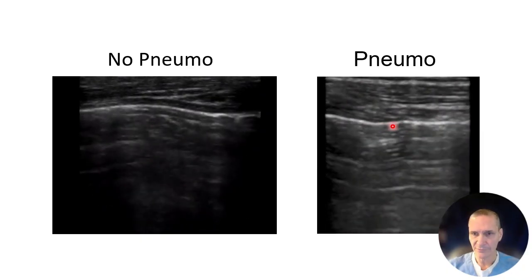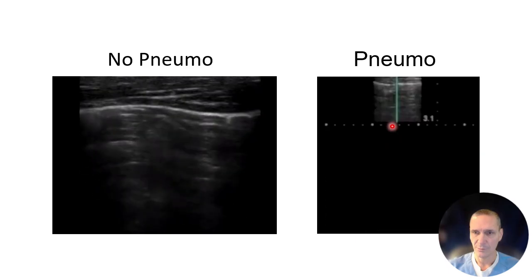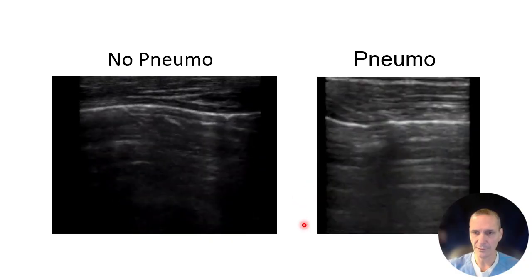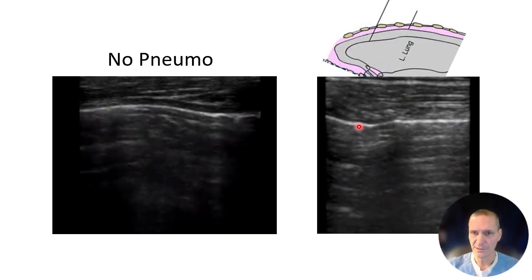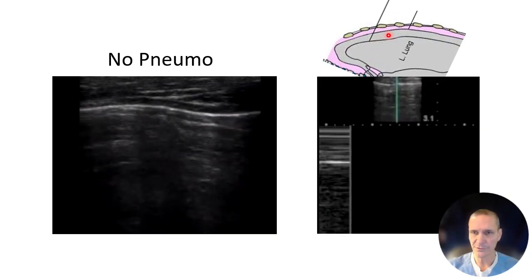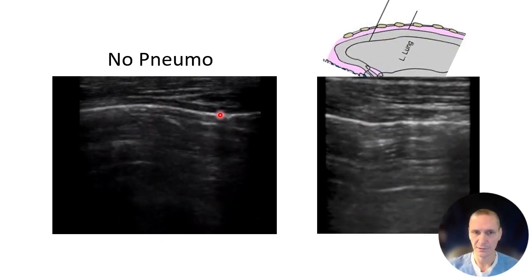This is live. Remember, 2D mode here, and then you're going to see they are putting this into M mode, and this is motion over time, and we'll talk about the findings you'll see there. So again, on this, when the lung is down or presumed to be down, the parietal and visceral pleura won't be together, so you're not going to see lung sliding.